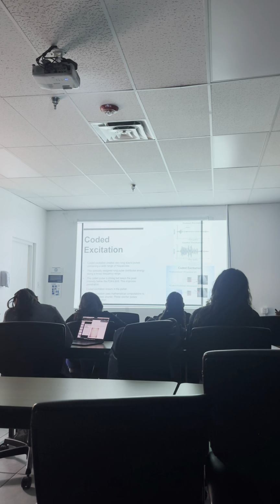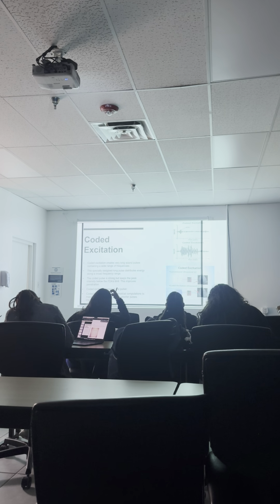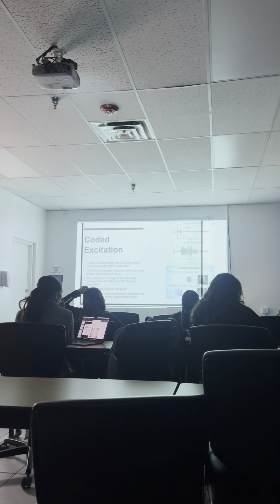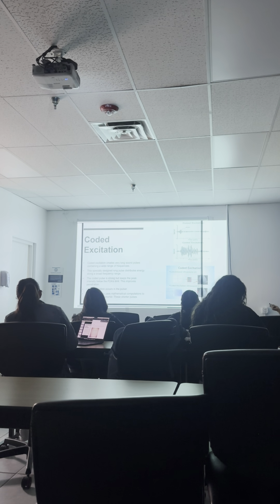Okay, so what is the benefit of that? Because we've learned that axial resolution is better with a short pulse length, right? So how does having a longer one benefit us? Penetration. It improves penetration, okay? And also if you notice, we have a variance of frequencies. This frequency is crazy, this one is a little bit more regulated, right?